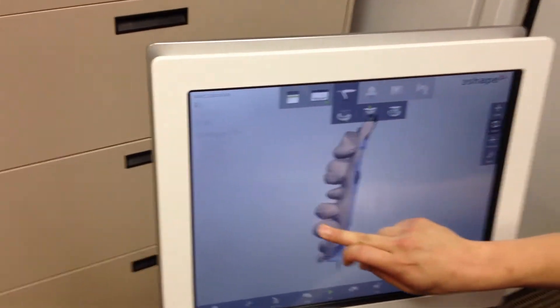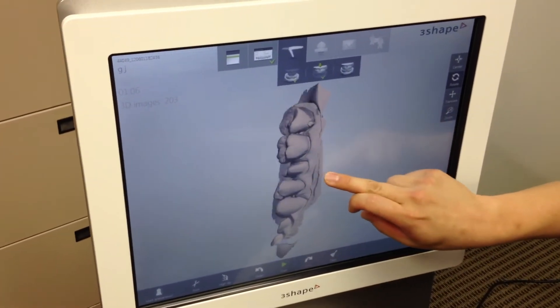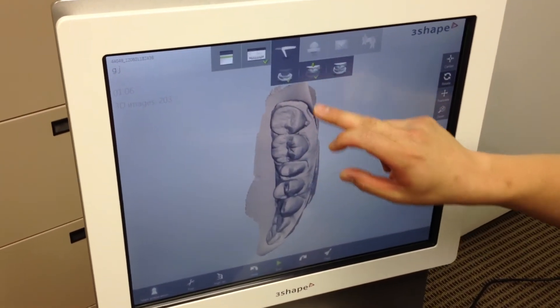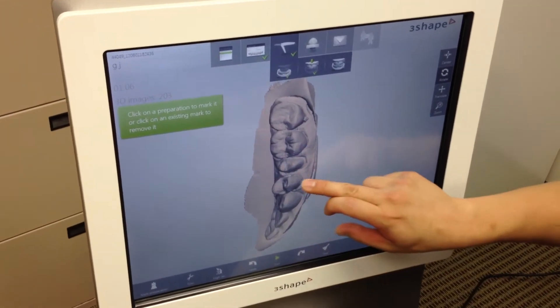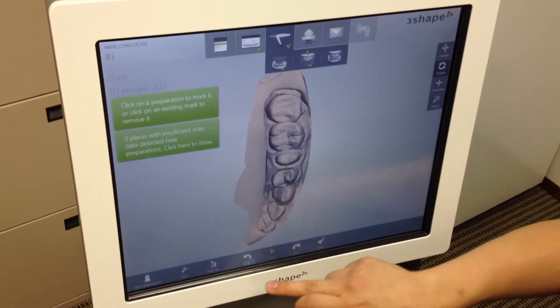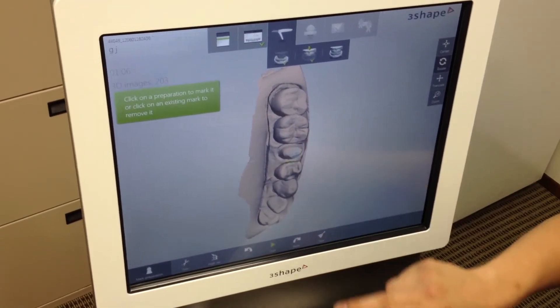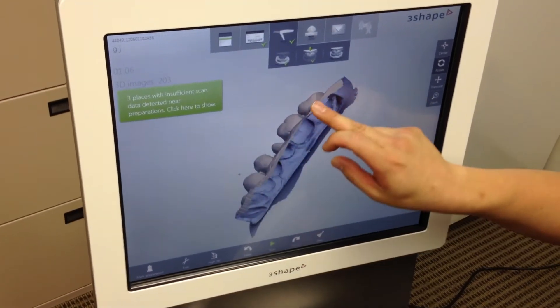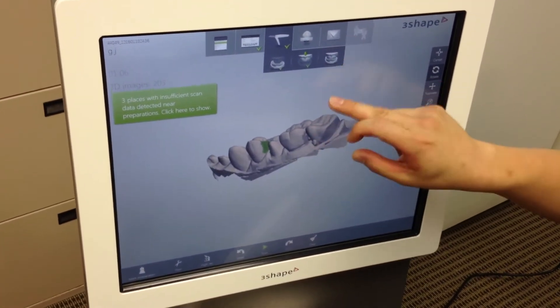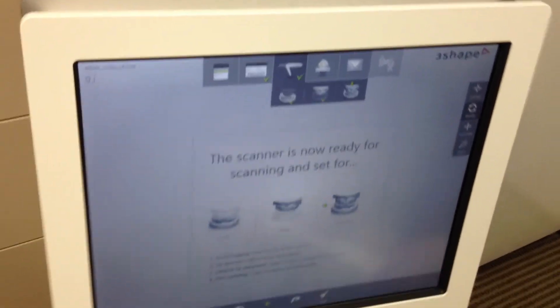Over here I get to mark my preparation. I'm just going to say that's my number four. Now I'm going to go ahead and open up a bite scan.